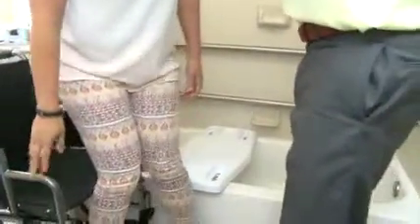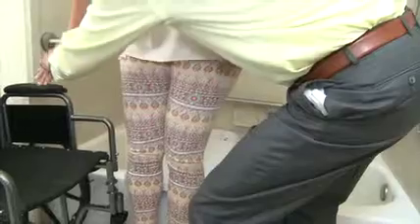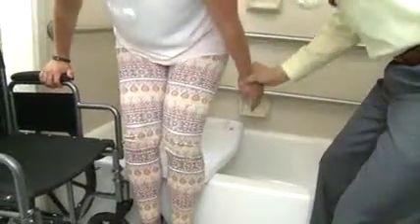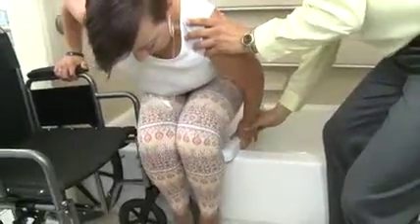Step 2. Provide assistance for the individual to stand and position themselves with the back of both of their legs touching the bathing board. Assist them to reach toward the bathing board with at least one hand, then slowly sit down. The wheelchair armrest can be used as a handhold to assist with sitting.